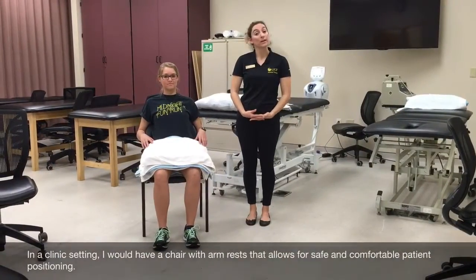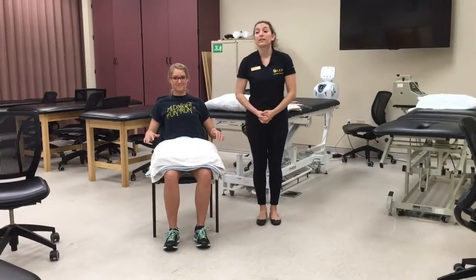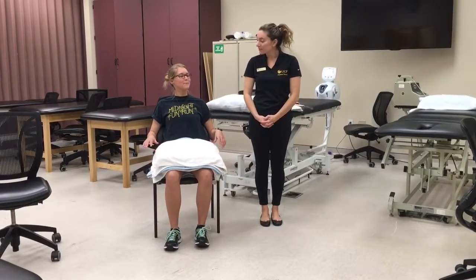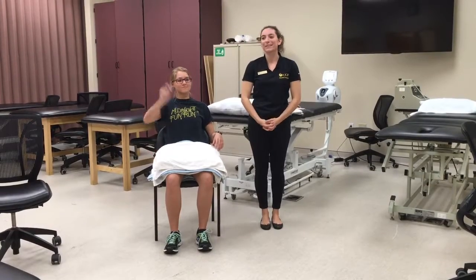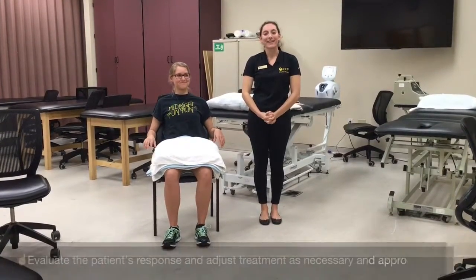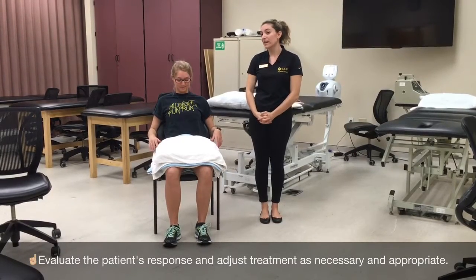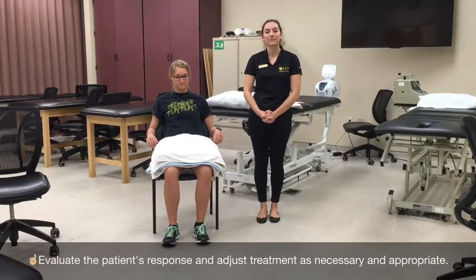Olivia is now positioned — and just to let you know, there are arm rests on this chair. I will make sure she's comfortable. Are you comfortable, Olivia? Great. If it becomes too hot, please ring the call bell to let me know. I will be checking your skin every five minutes for a total of 20 minutes. The treatment time is necessary in order for hemodynamic effects of vasodilation to occur and increase metabolic activity.